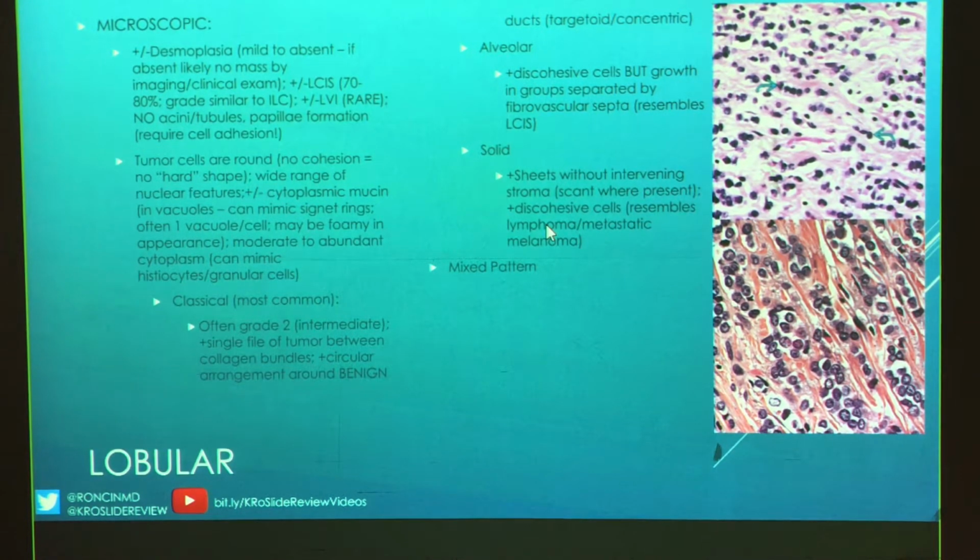You can see LVI, but this doesn't happen that often, to be honest, where it's significant LVI, and even your nodal mets. More often I've seen isolated tumor cells, which clinically don't really mean anything, than micro or even macro metastases.